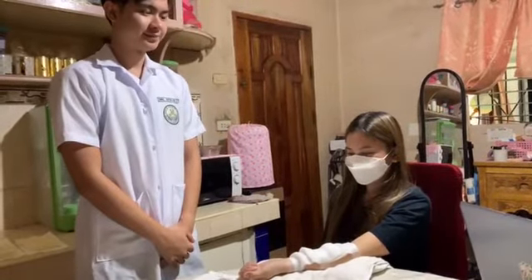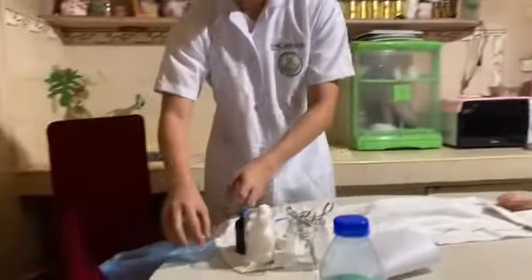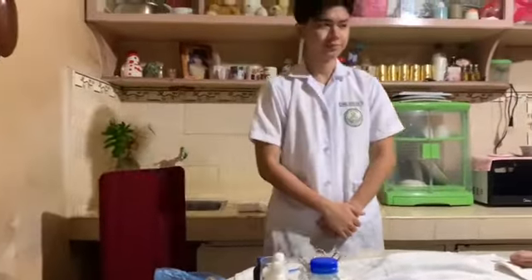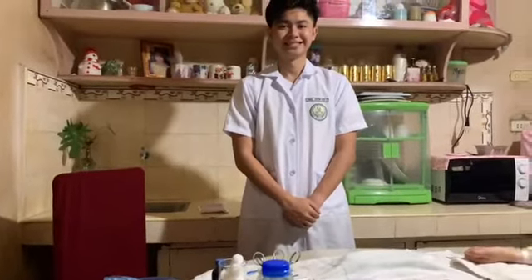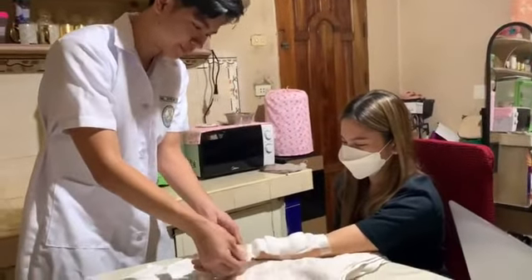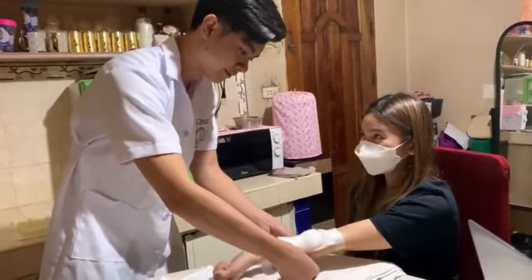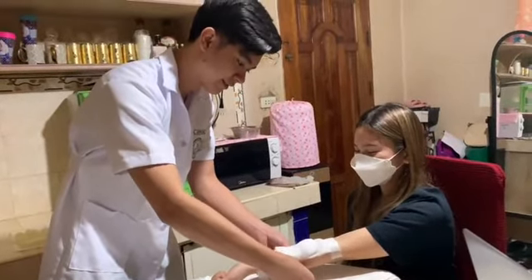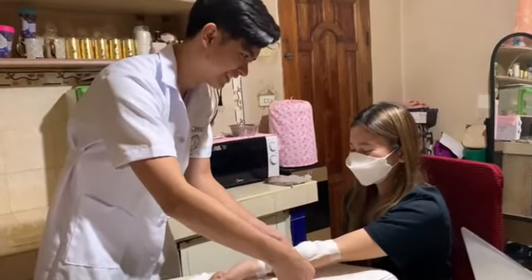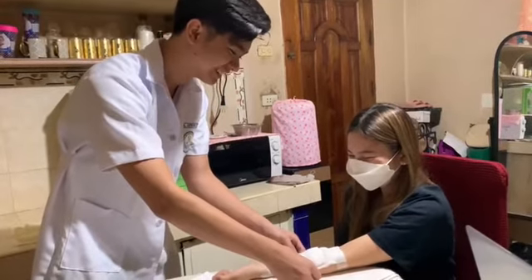Then, place an open cuff plastic bag near the working area. Soiled dressing may be placed in the disposable bag to control the transmission of microorganisms. Then, loosen tape on the dressing. Use an adhesive remover if necessary. It is easier to loosen tape before putting on gloves. When you are loosening the tape, please be careful, for the client can feel pain and discomfort. So please be careful and just take your time.